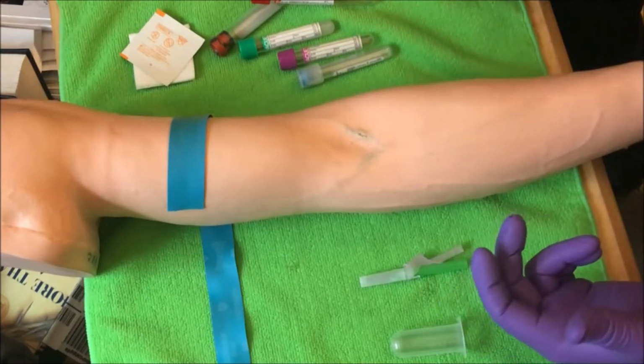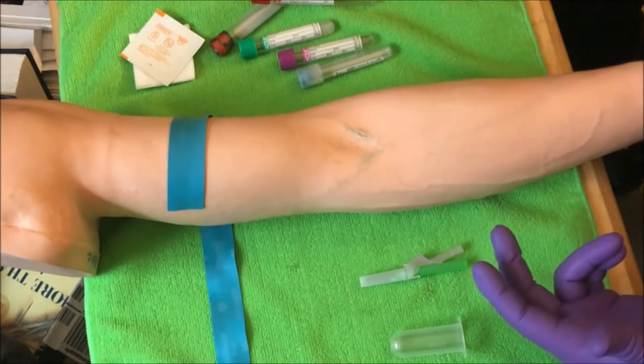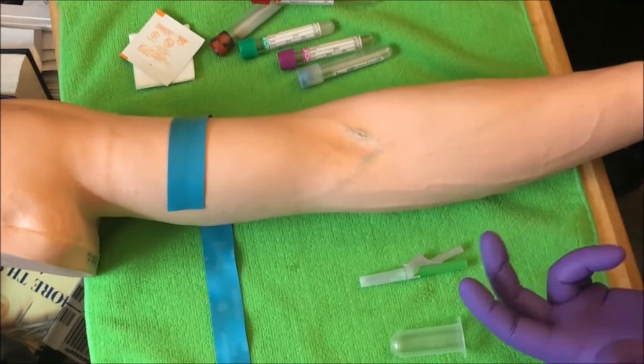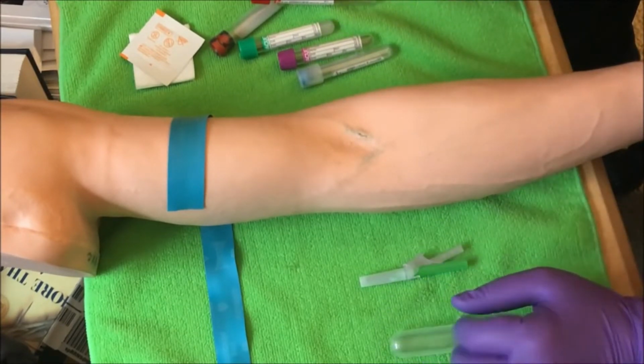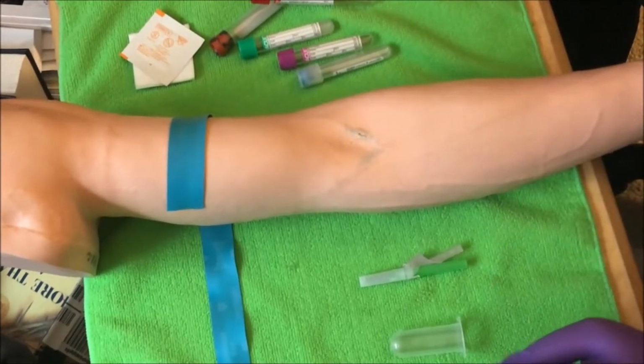There is a CLSI standard, that's the Clinical Laboratory Standards Institute. If you're not familiar with that, you need to go back and watch some of my videos on the agencies and different procedures that they recommend. Now, we already talked about the tourniquet. What I like to do, again, when I assemble my needle is exactly how I showed you. So what we've got to talk about now is locating our vein.